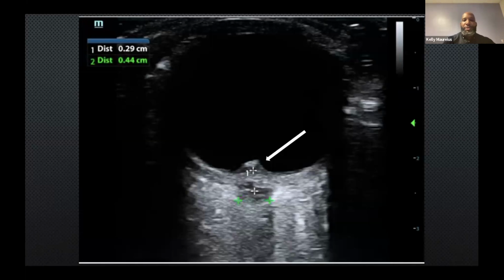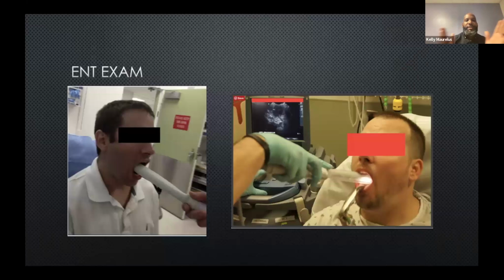All right, there are other measurements you can use, such as the optic nerve sheath diameter to the external transverse diameter of the orbit ratio, and that's also specific for increased intracranial pressure. All right, so that was the eye, just a quick breakdown of the eye.